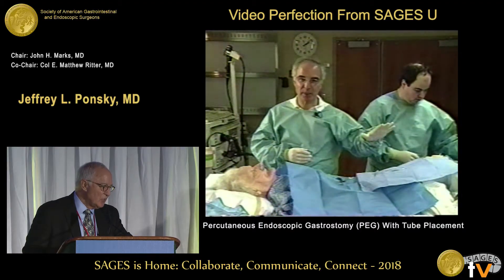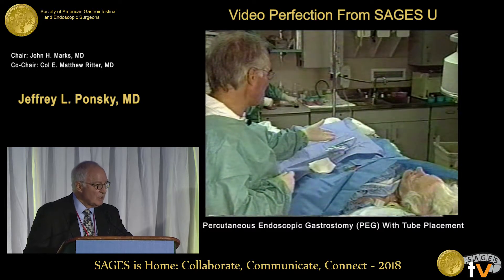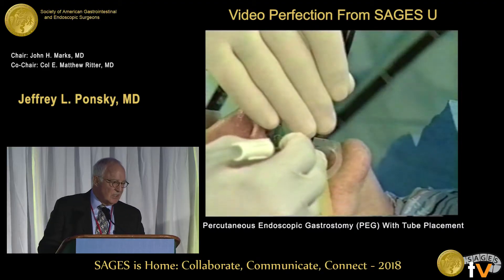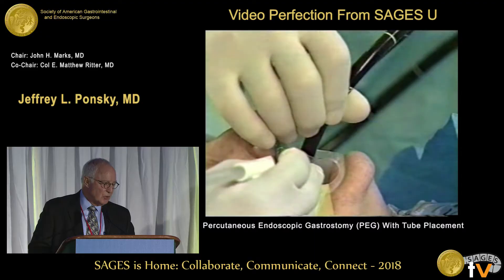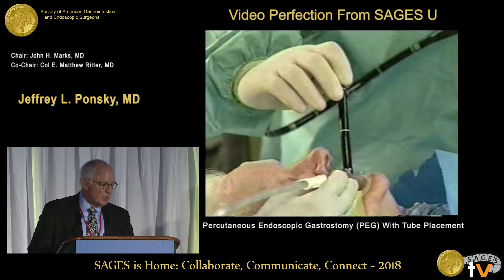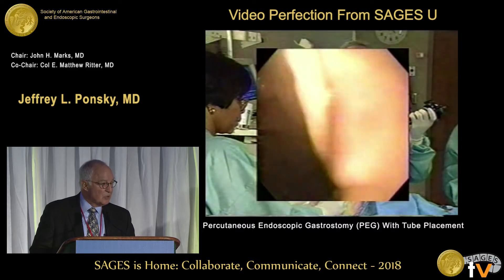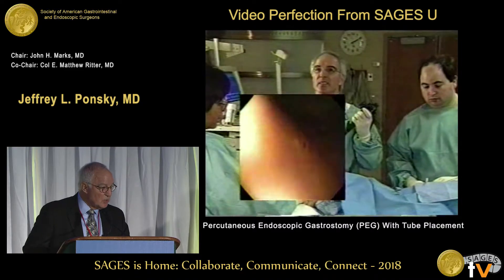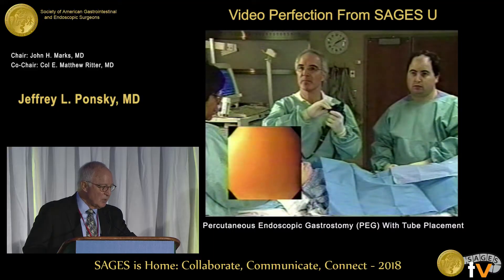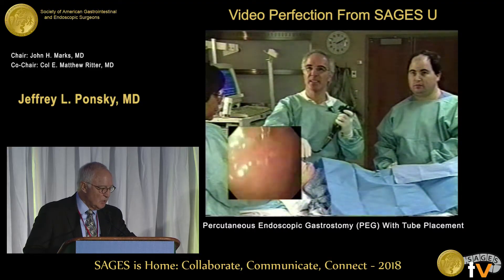We drape the abdomen. This is a two-person technique — we can do it with one person, but I think it's much safer with two people. I think the most skill is required at the abdominal area rather than in the endoscopic portion. We put five things up on the belly: the local needle and some xylocaine, the suture, and four-by-fours. Here we are going down with the scope. It's worth taking a while to inspect the stomach before you try to do anything. I don't like to put a lot of air in the GI tract, but I do like to go into the duodenal bulb at least and make sure there isn't an ulcer. Brian Duncan years ago did a study showing that about a third of patients may have some disease in the duodenal bulb. We get in the duodenum, make sure the bulb is okay, and often don't go much farther than that. There you see the duodenal bulb — it looks just fine.